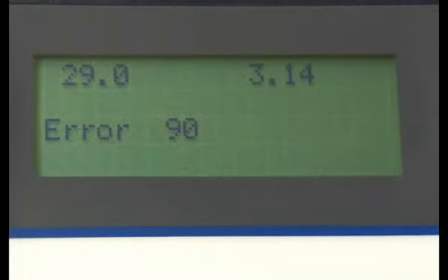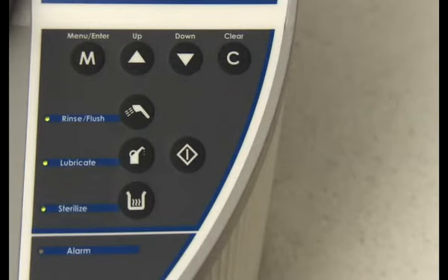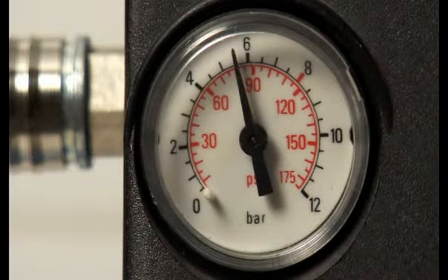Error 90 indicates low air pressure. Please press C to cancel the error code. Please check that the incoming air pressure from the air compressor is between 5 and 8 bars.